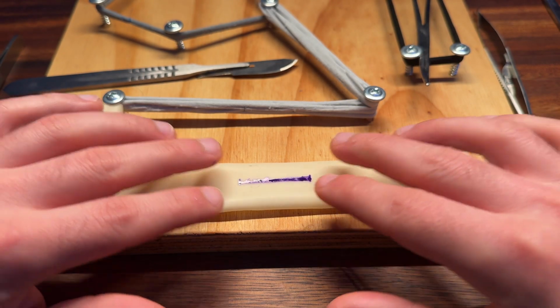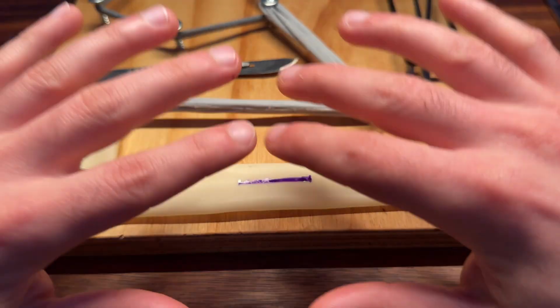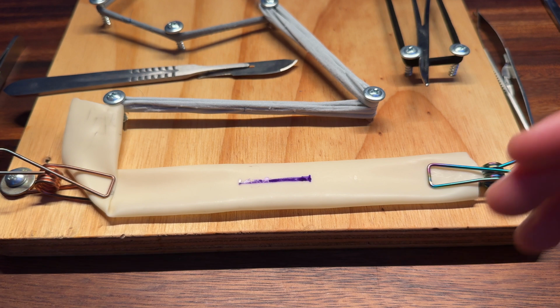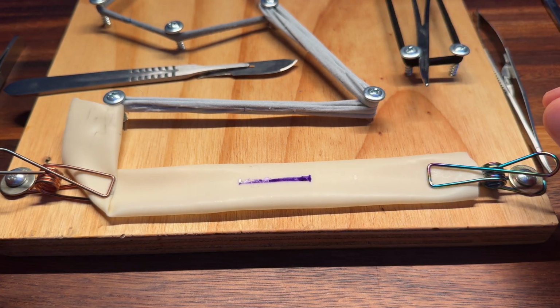So first of all, what are we doing here and why? The patch angioplasty is really designed to close blood vessels after you've made an incision in them for whatever reason, maybe like a carotid endarterectomy, right? You're cutting into the carotid to remove the atherosclerosis.